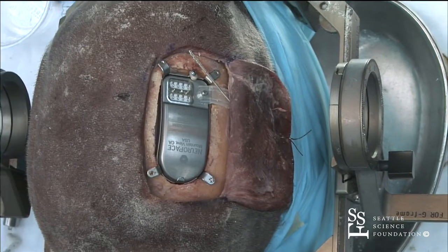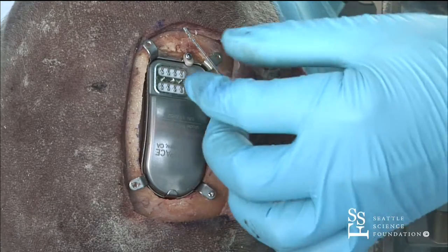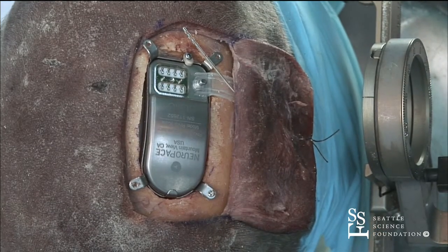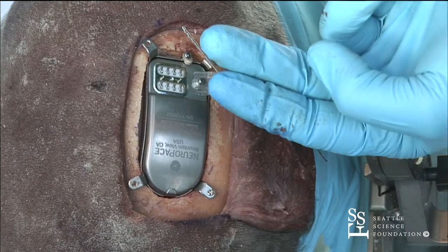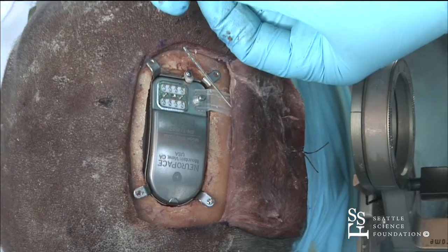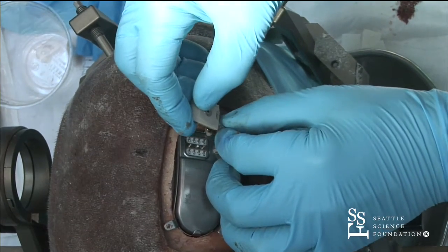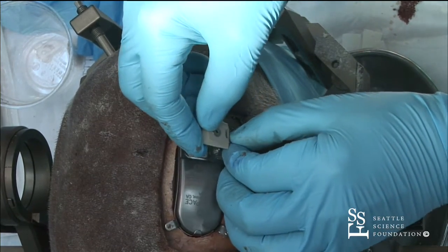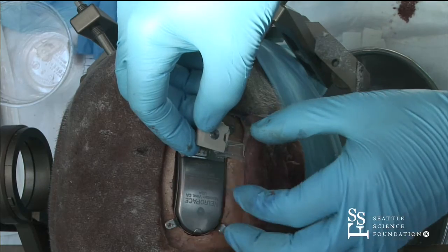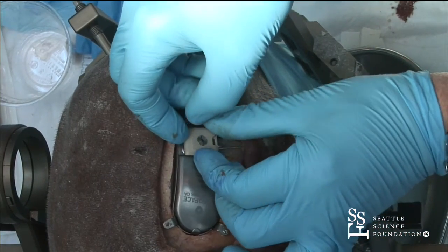And there's one more piece. This is the cap. And typically we'll have two electrodes, so there's one on each side. We'll have two coming up into here. You can see they're numbered right here, 1 and 2. And typically for a left, we put into 1, is that right? We put a left side into the first port and a right side into the second, just for consistency's sake.